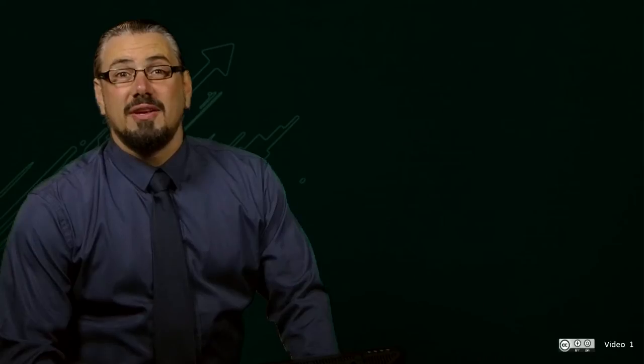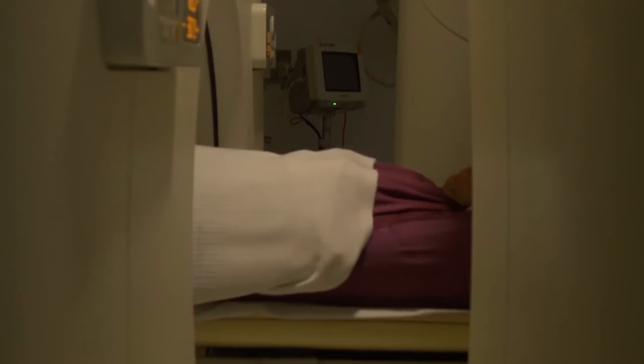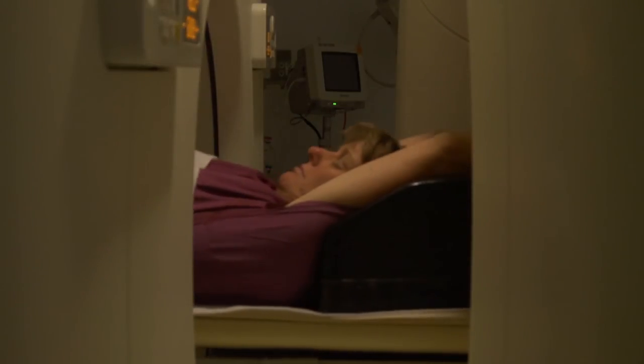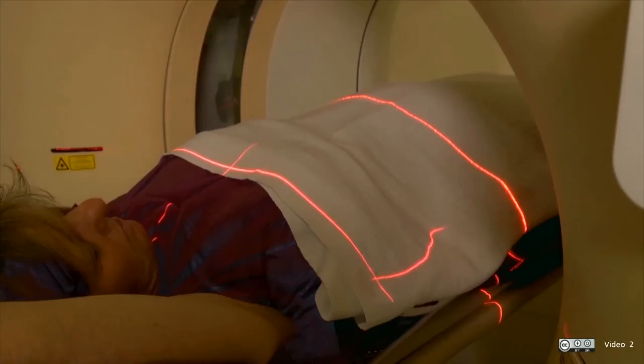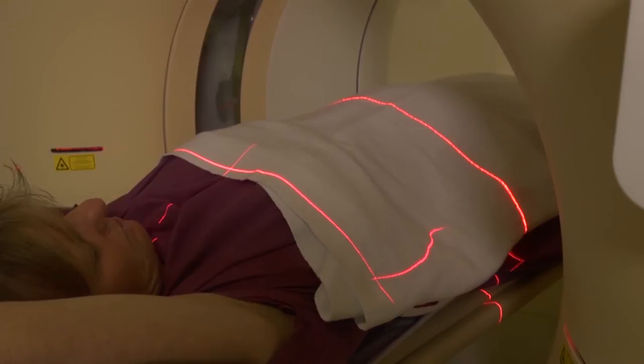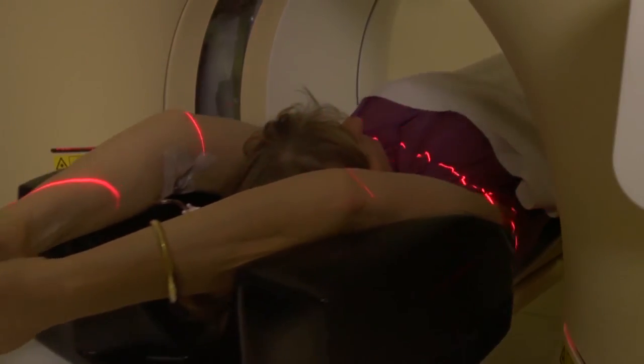The patient is then transferred onto the bed of the PET CT scanner. This bed is then moved into the gantry of the scanner so that the patient can be positioned correctly for the scan. The red beams of light that you see are to assist with the positioning of the patient.